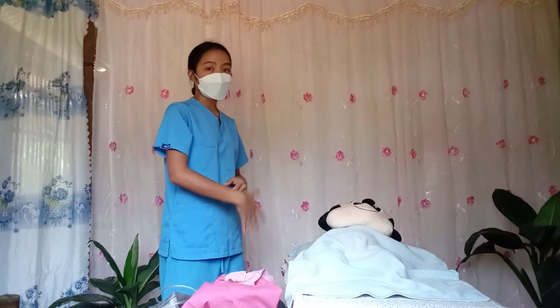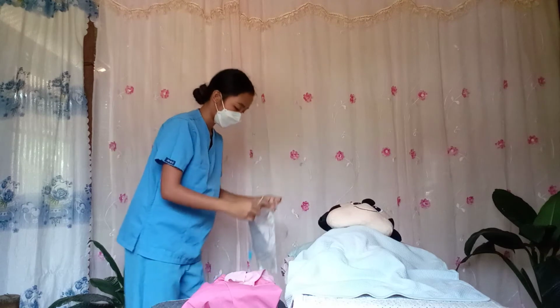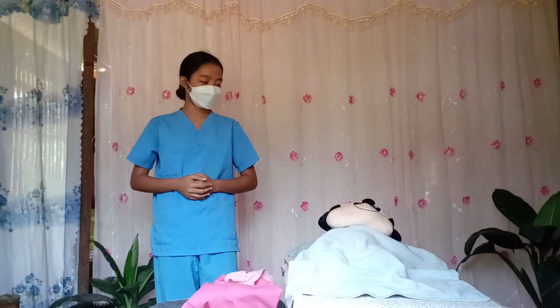The next thing that we're going to do is secure the urine bag behind or beside the patient's bed frame. Then drape the patient, exposing only the area to be used.